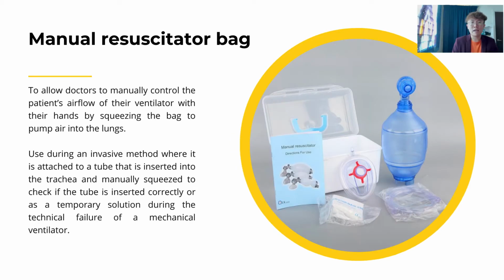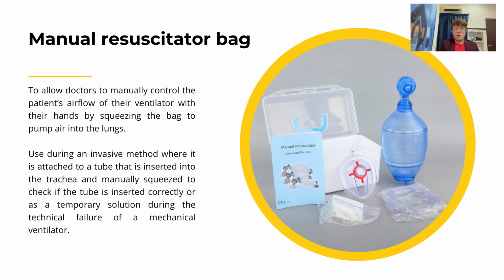Thank you. Air blows into the airways and lungs. It is used as a first aid material before sending the patient to the hospital. I will now pass the time to Carlo, where he will talk more about the positive pressure ventilators.